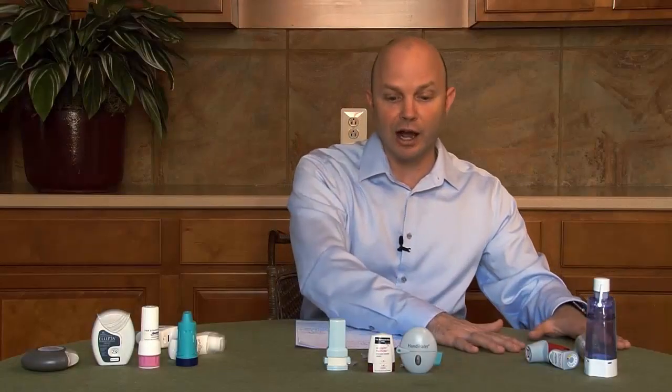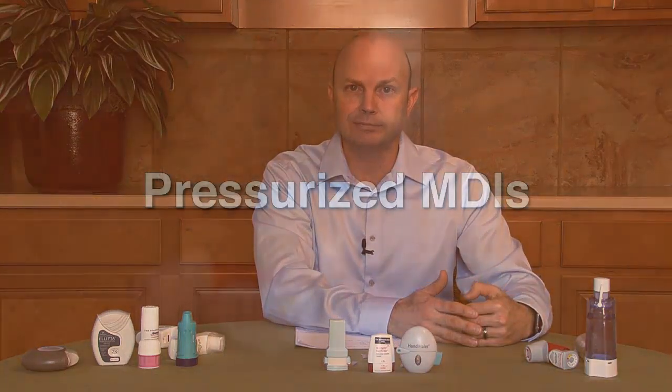So now what we're going to do is take a look at each of these different groups of medications, and then you're going to see tutorials on how to take each specific device and the steps properly needed to inhale the medicines into your lungs.